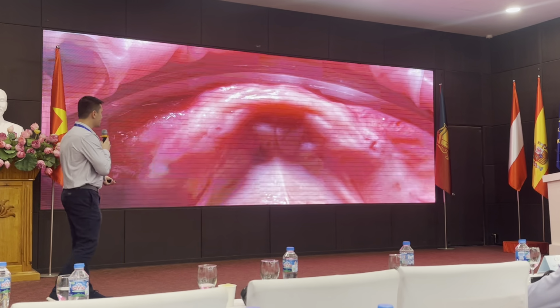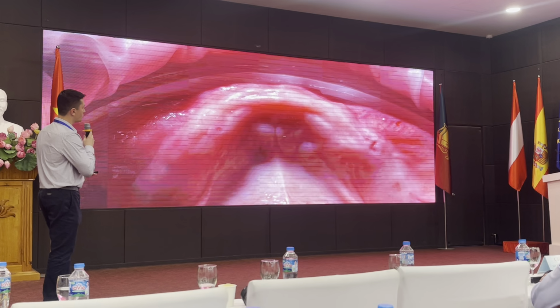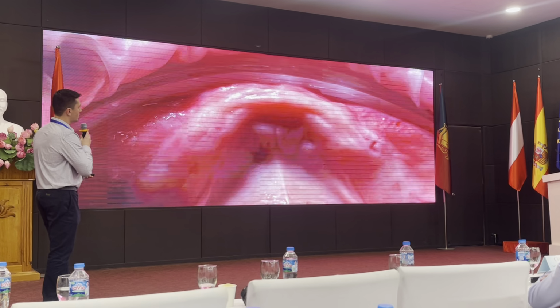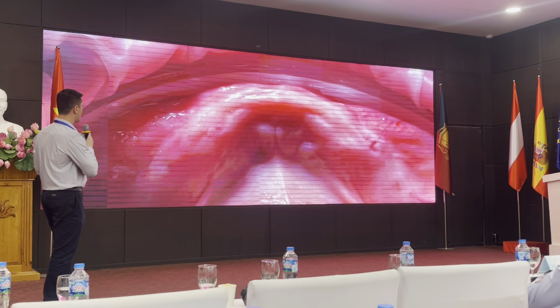So this is how he presents. This is the mandibular arch. You notice another thing here is he's got these lingual tori present, and we know that that is going to affect how the prosthetic sits on this bone here. But the bone is very wide, lots of keratinized tissue.